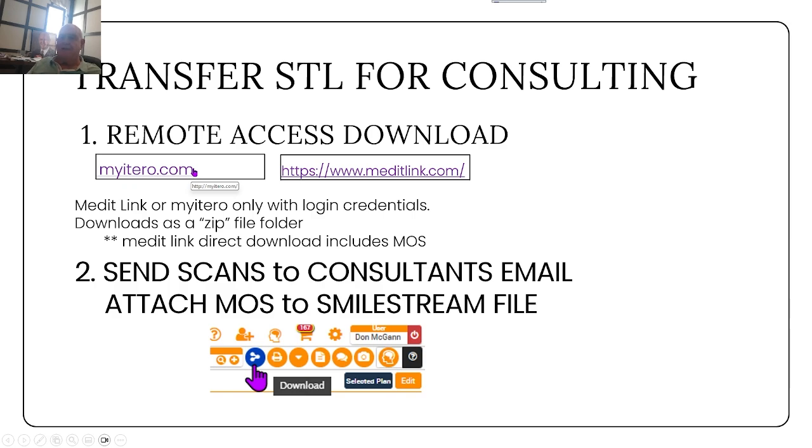That's the most convenient. Otherwise, you have to export from your iTero, let's say, and attach it to an email, or if it's too large, you have to make multiple emails, or you can send it by WeTransfer or Hightail or something like that.